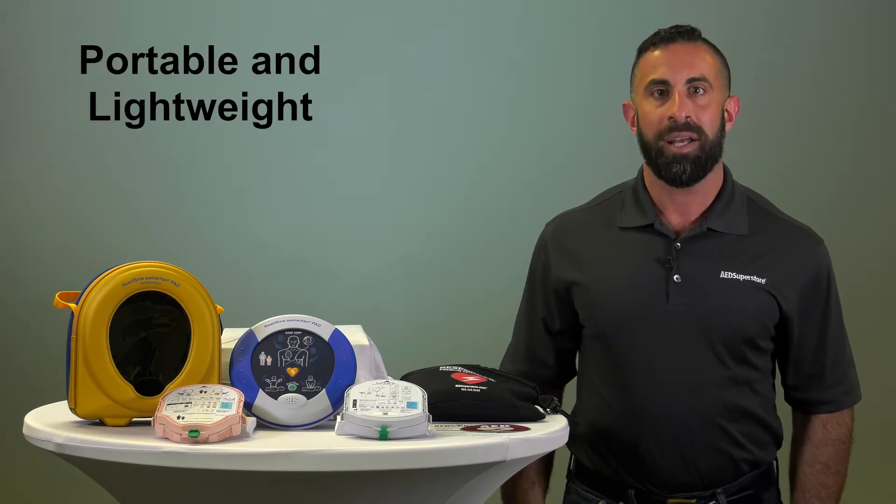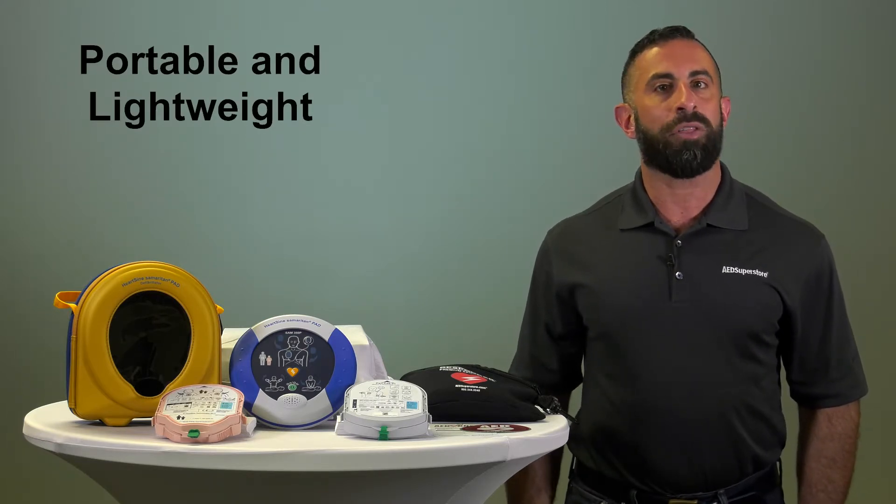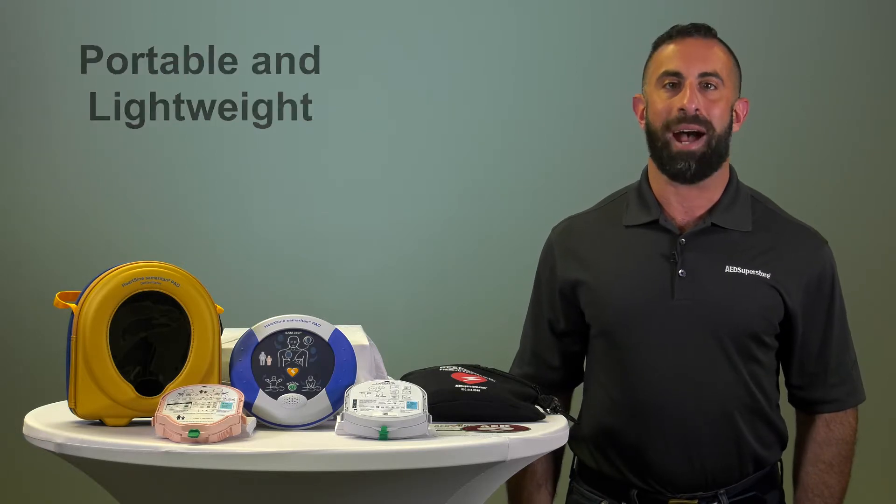One of the most popular features of the 360 and 350p is how portable and lightweight they are. The AED is the smallest on the market and weighs only 2.4 pounds.